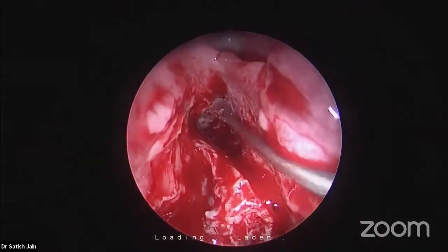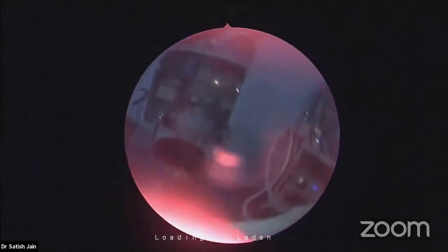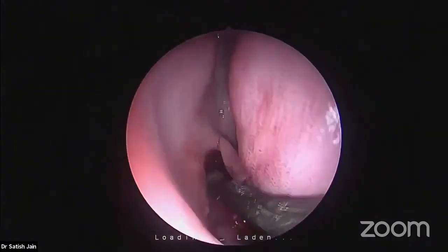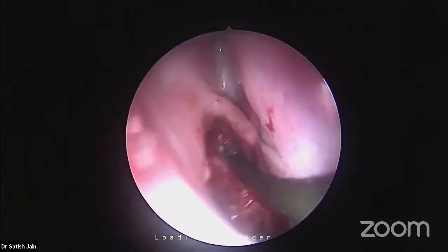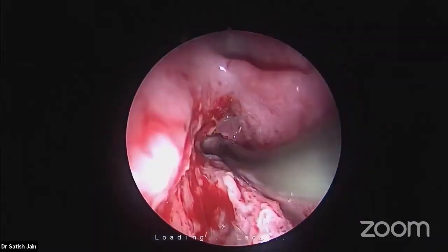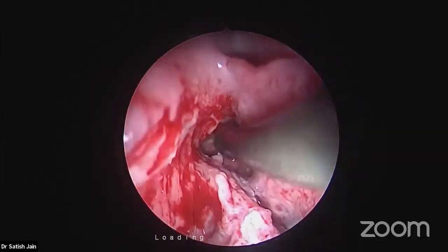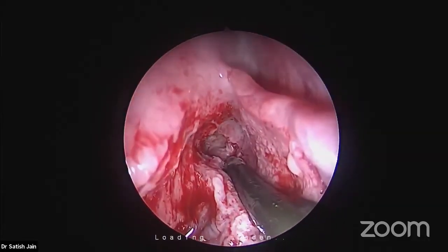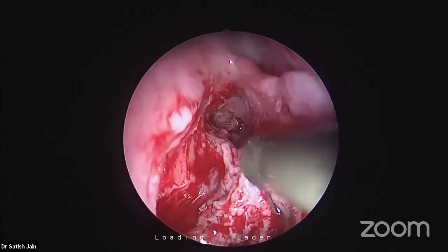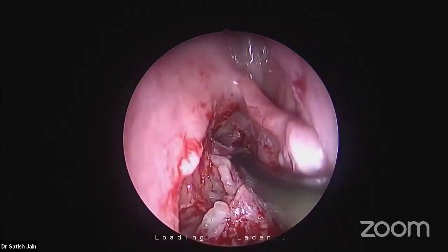Your anterior ethmoidal artery is miles away. It is in the posterior most part of the ethmoidal roof. Once you are working in this region, you don't need to be terrified of the anterior ethmoidal artery. First, the beginning of the ethmoidal roof is more than a centimeter from the beak. More than a centimeter behind is the beginning of the ethmoid. And the end of the ethmoid is going to be the anterior ethmoidal artery. So don't get terrified.